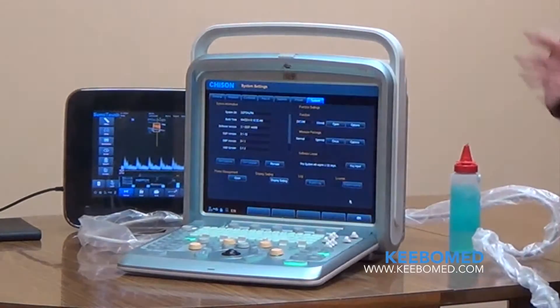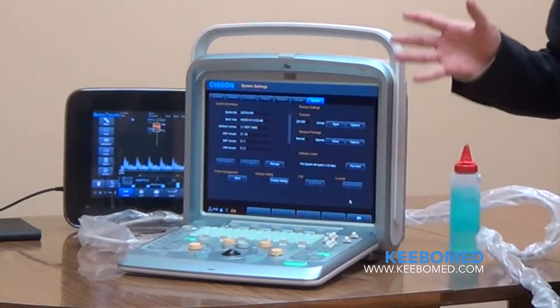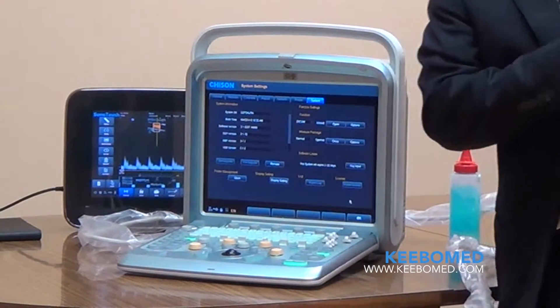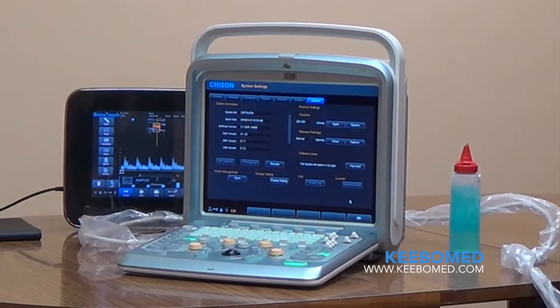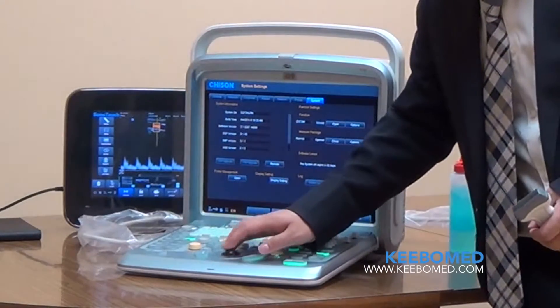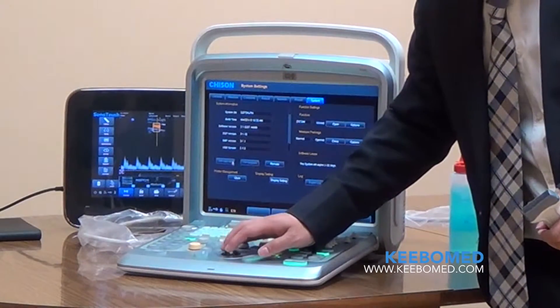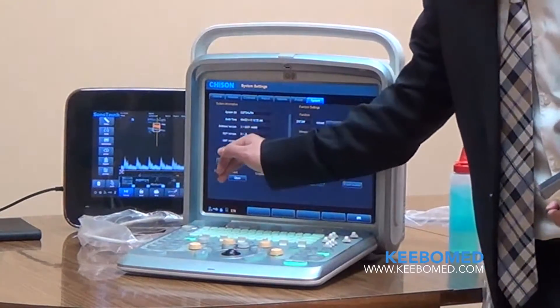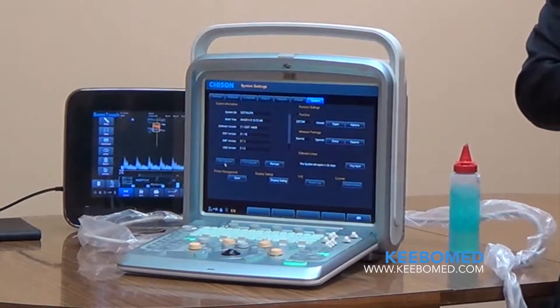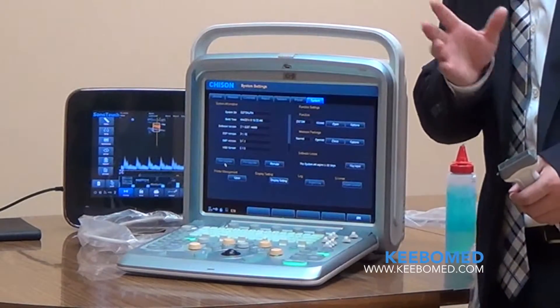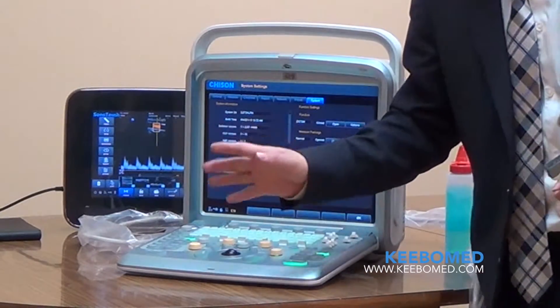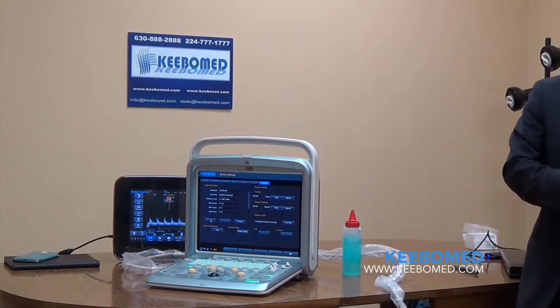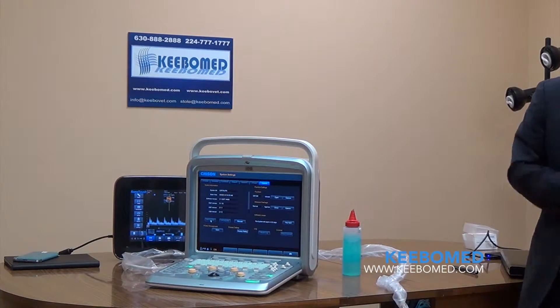The last thing for this system is that it is very easy to service, and we know service is very important in the United States. For this system, we have a function called One Key Upgrade. You can see the software version and the firmware version — both just need you to copy the update package into a USB drive, and then one key handles the upgrade. Those are the shared features for both Q5 and Q9.